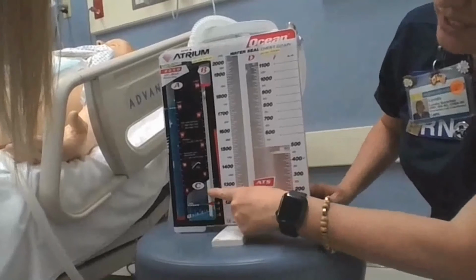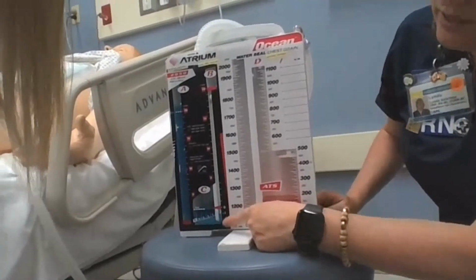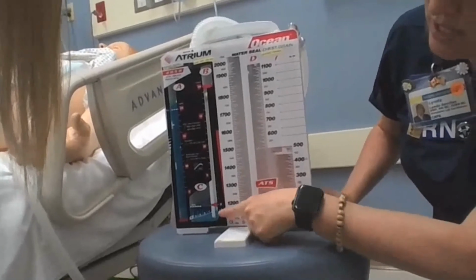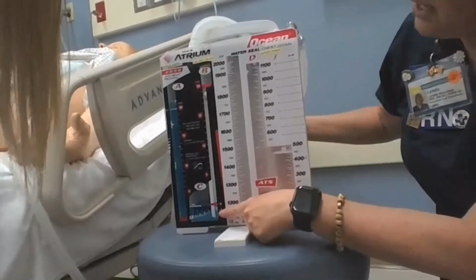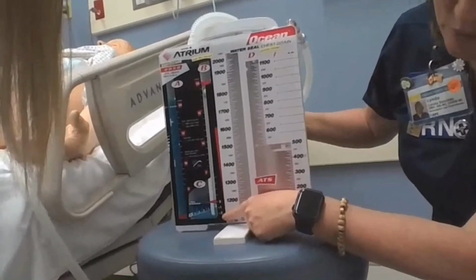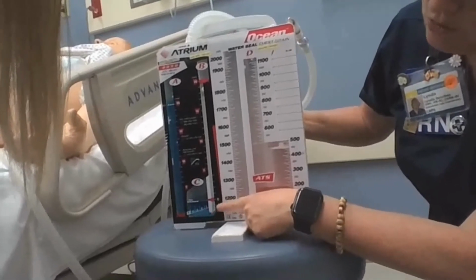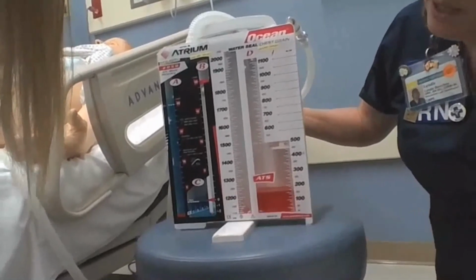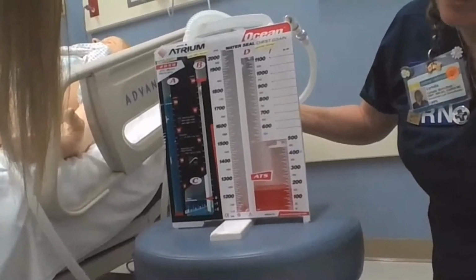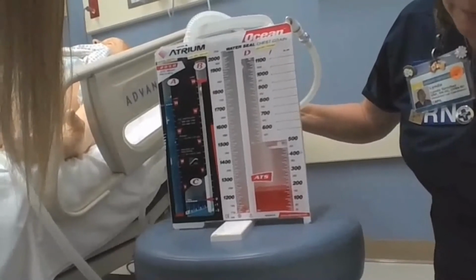The next chamber we're going to look at is chamber C. Chamber C is your water seal. Now, in your water seal, you should have 2 centimeters of water, okay? And then you have this little ball here, and that little ball rises and falls with inspiration, okay? It should be rising between 0, +1, and +2. That ball rising up and down is called tidaling, okay? So every time the patient breathes, that ball is going to move up.